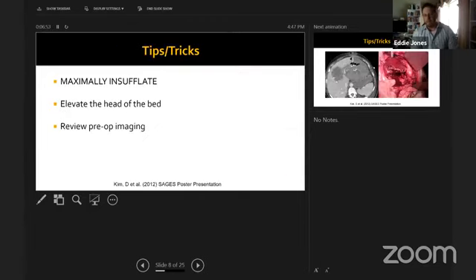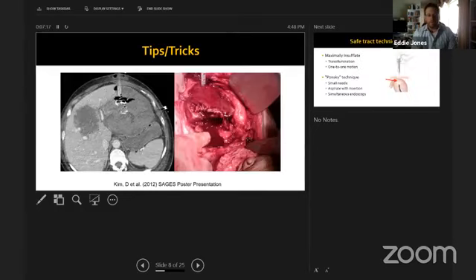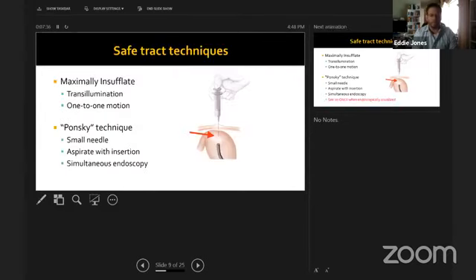The safe-track technique uses a finder needle with aspiration as it is inserted — air should only appear in the needle when the endoscopist sees the needle tip. If air is aspirated without endoscopic visualization, the needle may be in another luminal structure. The skin incision should only be large enough for the tube — there is no need to enter the stomach lumen with the blade.